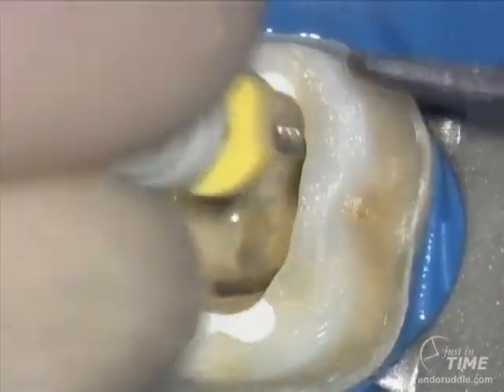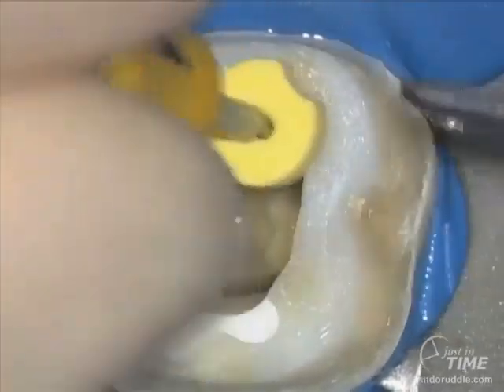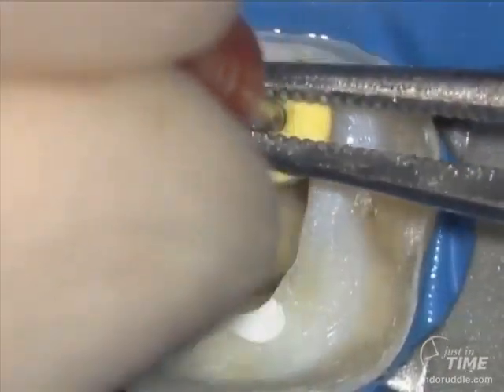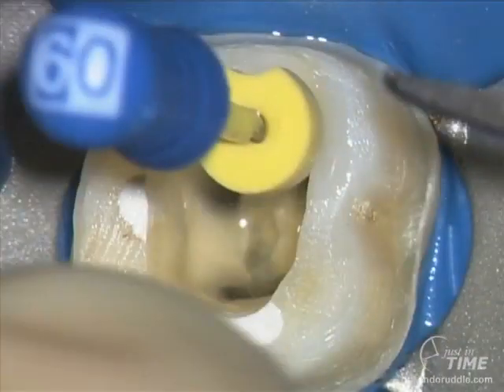They're simply placed into the root, and the assistant pushes the stop down so that I can look at all the instruments in a series and look at the relationship of the rubber stops to each other. And this is how it would look.